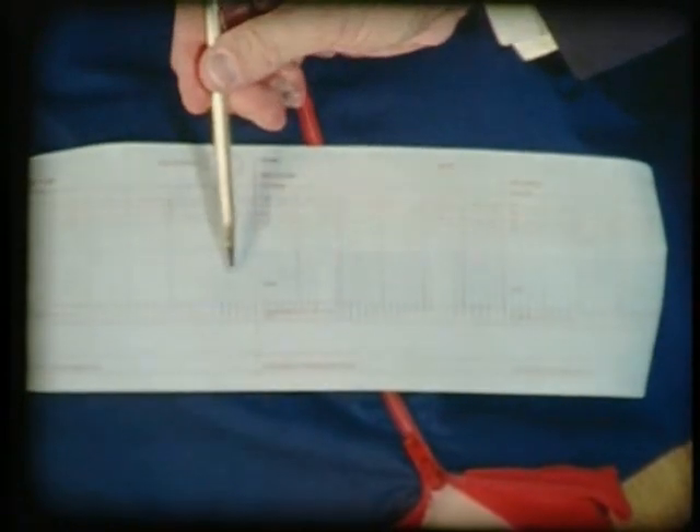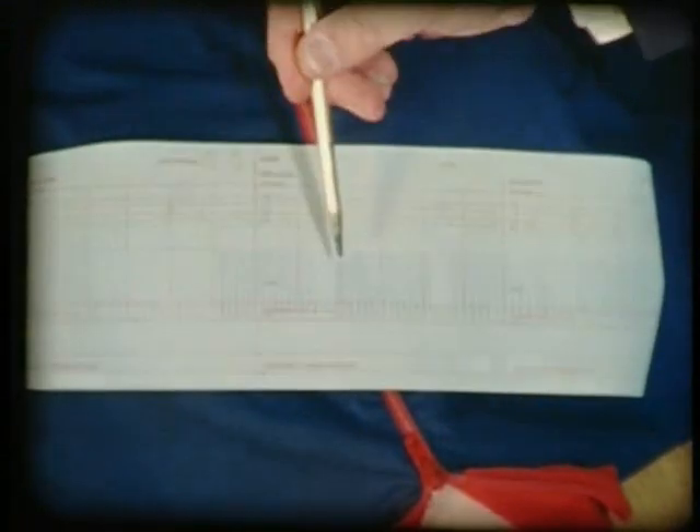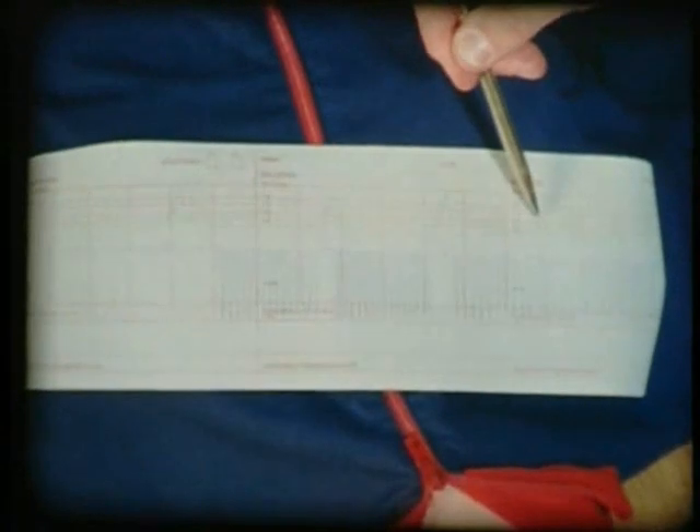The record shows the effectiveness of four quick breaths, correct 15 to 2 one-rescuer CPR, and 5 to 1 two-rescuer CPR.